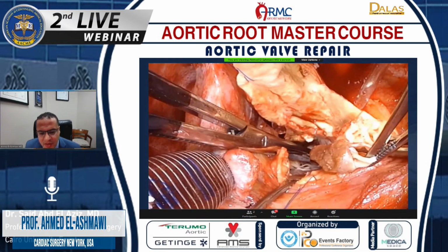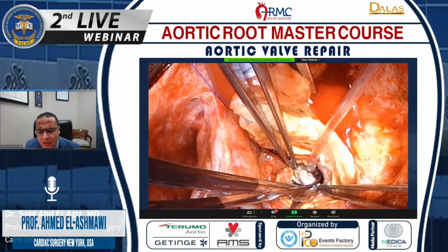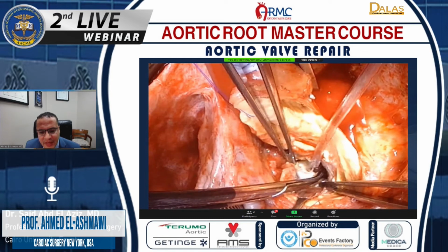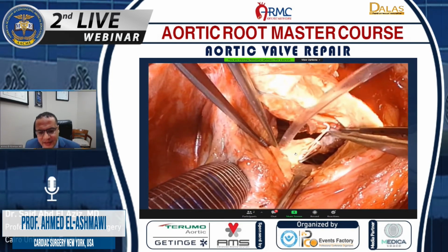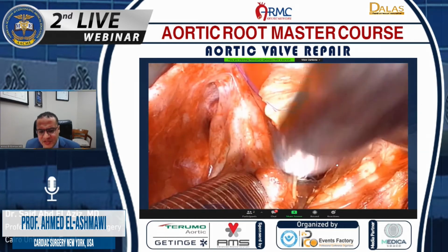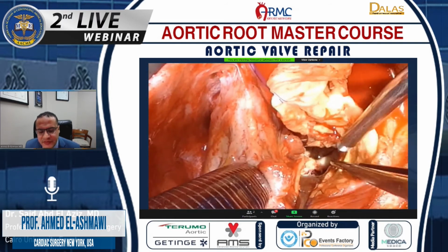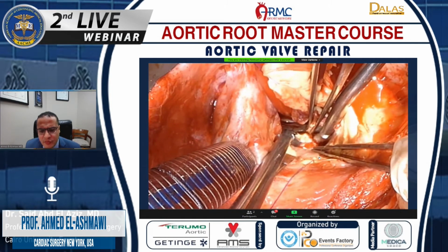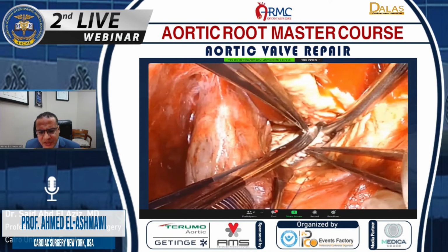Those patients usually have a small left ventricular cavity. We took out most of the subvalvular apparatus, leaving only a few connections to the posterior annulus just to prevent AV groove disruption. We then resected the anterior mitral leaflet, leaving only 2 millimeters of the annulus, and that gave us perfect exposure to the posterior annulus. This patient had a lot of calcification, so we did debridement of the calcium from the posterior annulus. You don't need to get too aggressive, so you avoid AV groove dissociation.